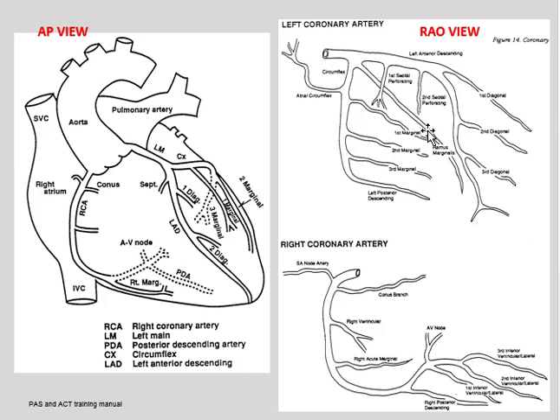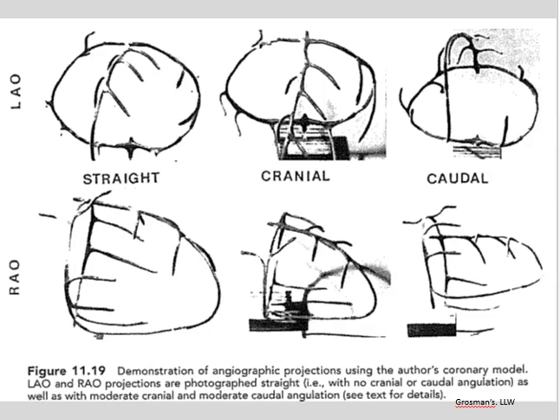This has another artery called the ramus intermediate. It's another marginal branch, but it arises right in between the LAD and the circumflex. If it arises from the circumflex, it would be just another marginal branch. And you notice these branches, marginal branches, come off the circumflex. Septal and diagonal branches come off the LAD. And they're just numbered, first, second, and third diagonal, first, second, and third marginal, and first, second, and third septal. You need to become familiar with the coronary anatomy, but more importantly, learn how to identify them in our X-ray images.